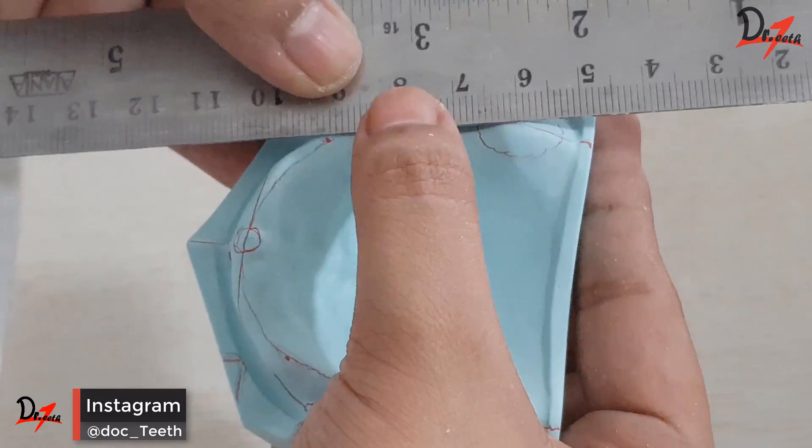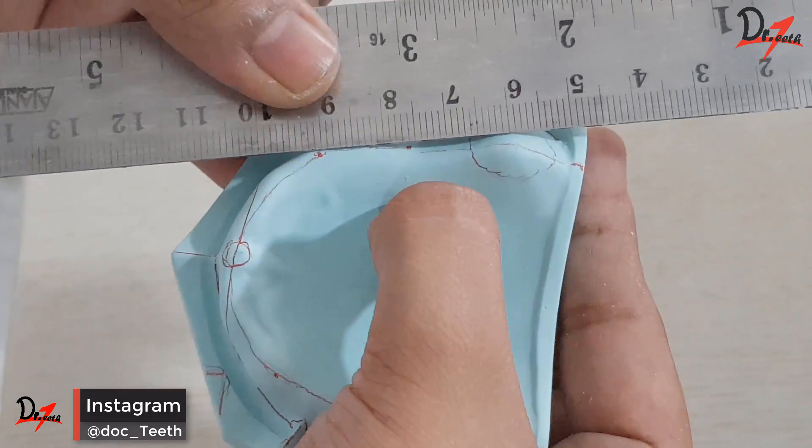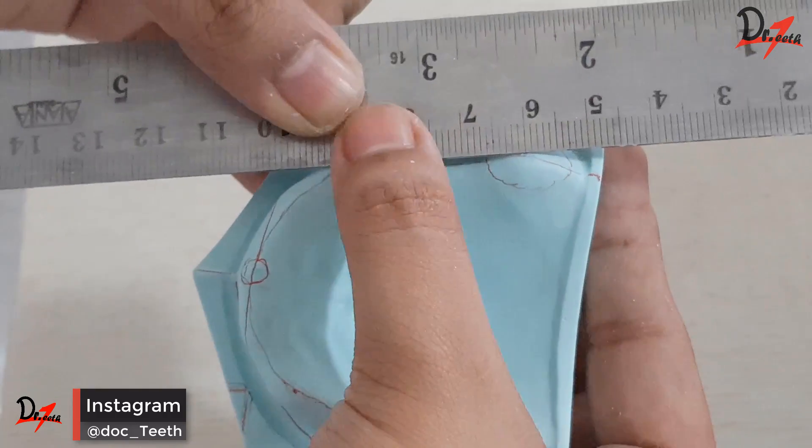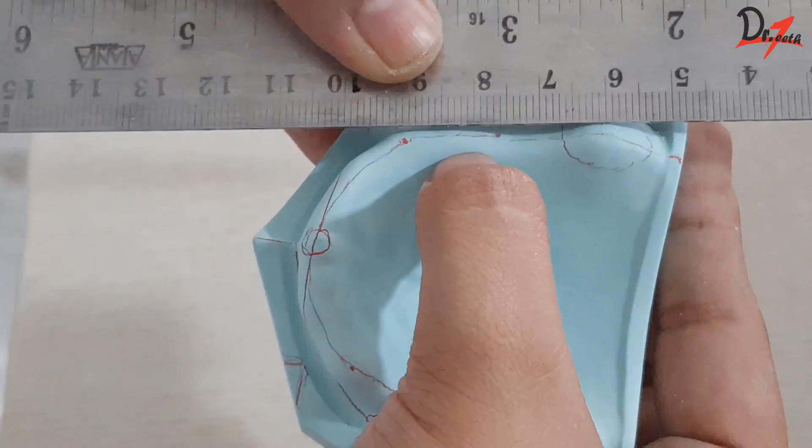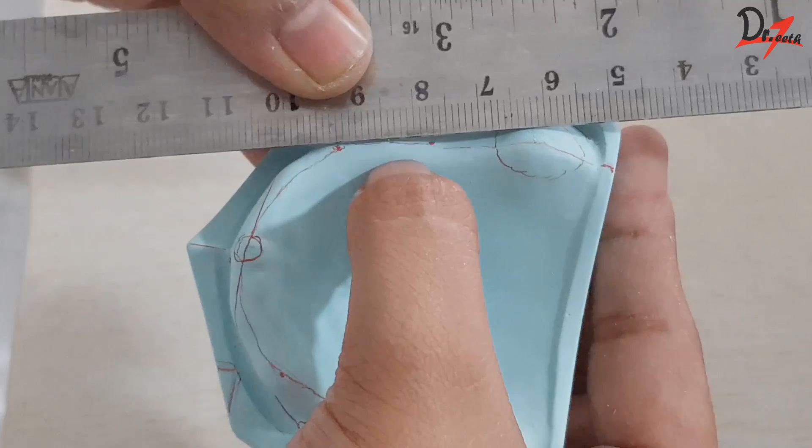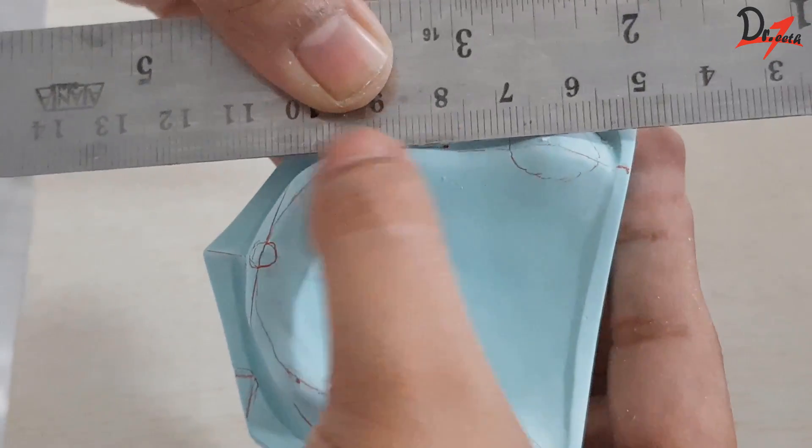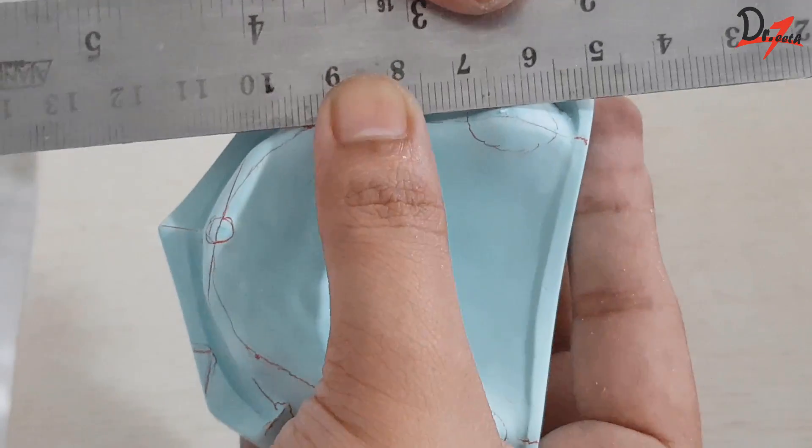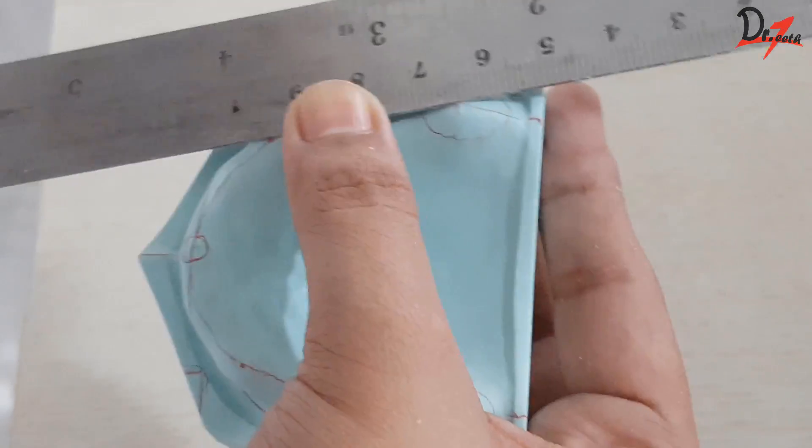So as you can see, I am trying to extend the line on the anterior land area of the cast. So now we are done with the cheat lines that will help us while making rims, while teeth setting and even while mounting. So I hope you found this video helpful.